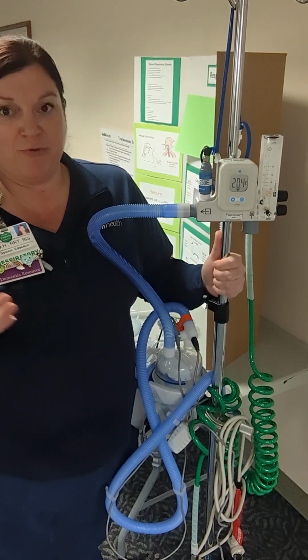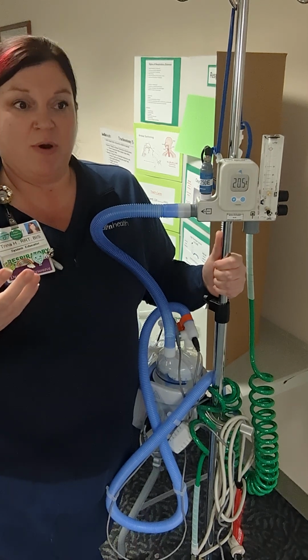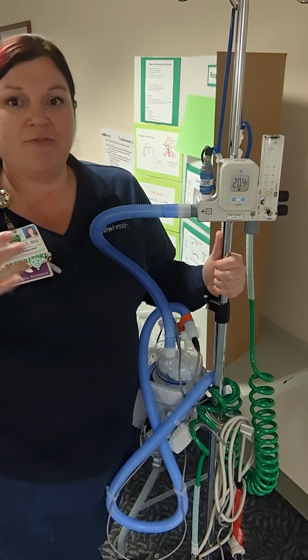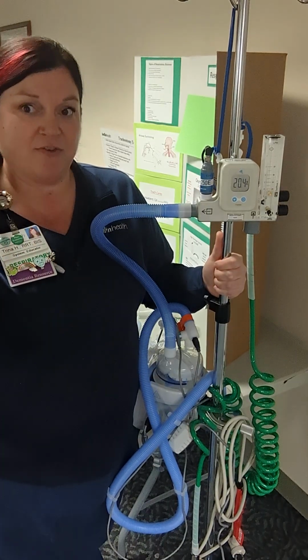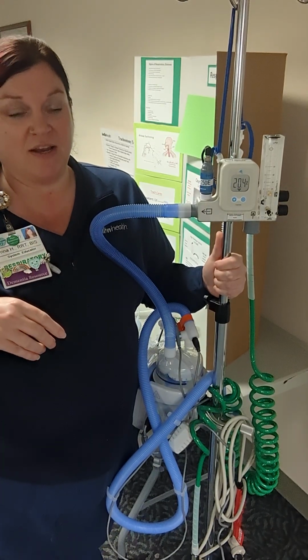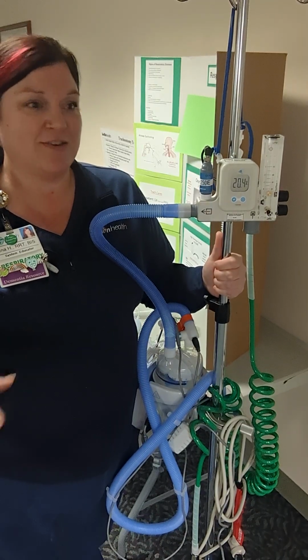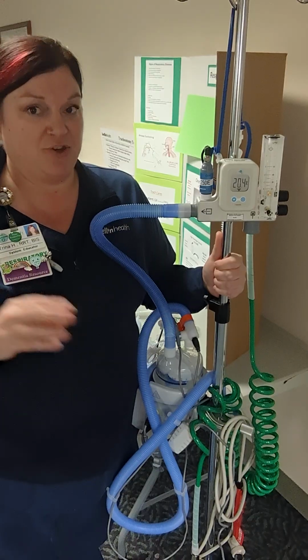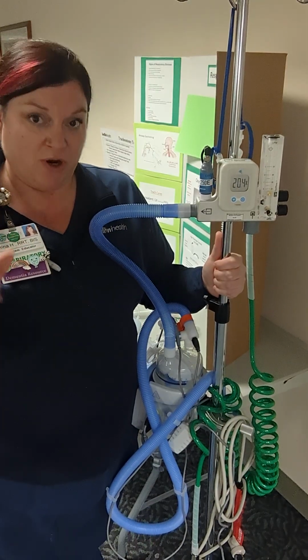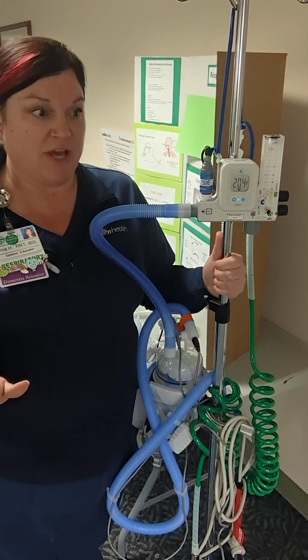So if we're on room air, I would expect to see 21%. We might go up to 30%, 35, 40, 45, 50. I like to go by increments of 5% or 10%. If I know for sure that they need more than just 40%, if I know like, hey, this person's saturations are very low, you are allowed to go up and come down. So don't be afraid to do that.